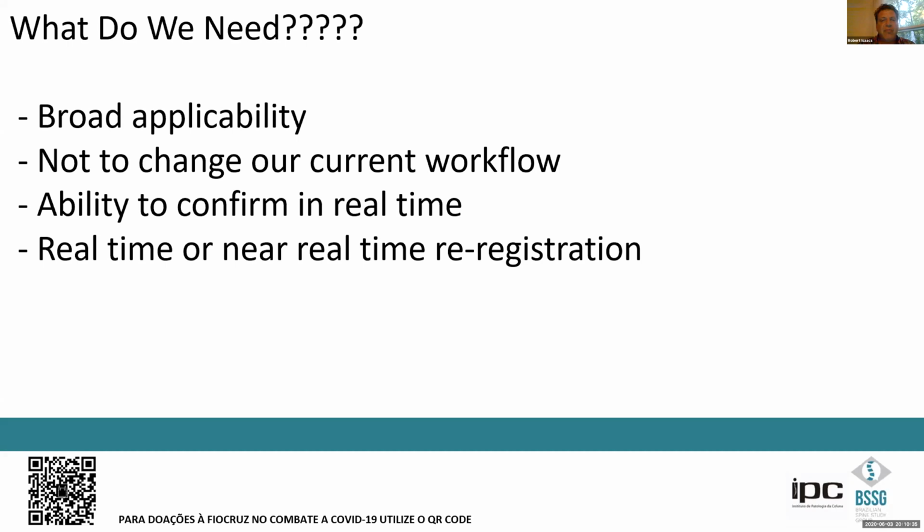And so until we have more broad applicability, until these systems allow us to either significantly improve our outcomes or don't make us change our current workflow and add benefit, then I think there's a significant hurdle for their wide-scale adoption. And because they're expensive machines, they add some real negativity to the OR experience.